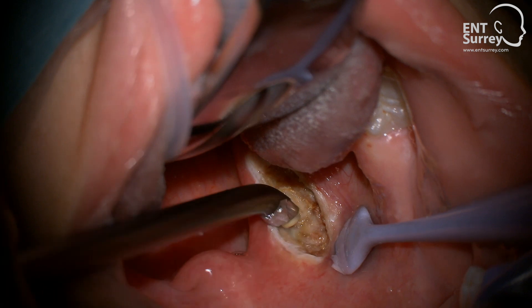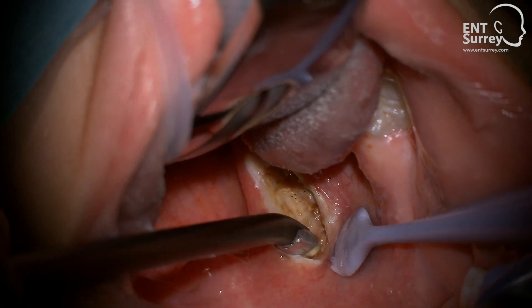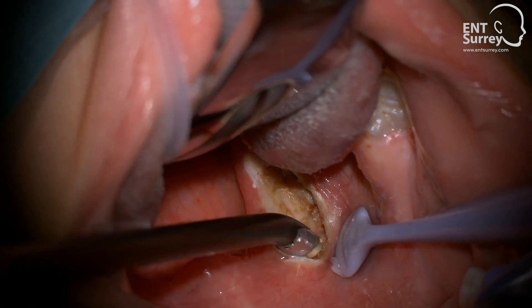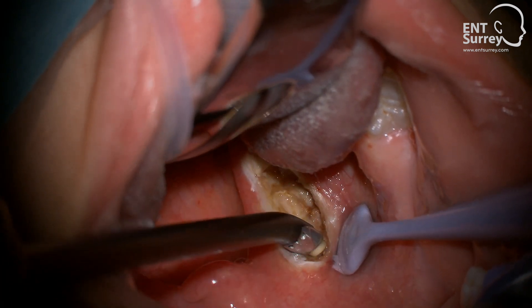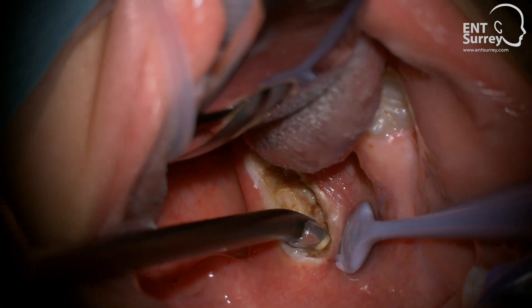If bleeding is encountered, it can be managed by a short touch of the coagulation pedal while contacting the face of the wand against the bleeding vessel. Assuming the capsule is not breached, even in adult cases, intraoperative bleeding is generally quite minimal.